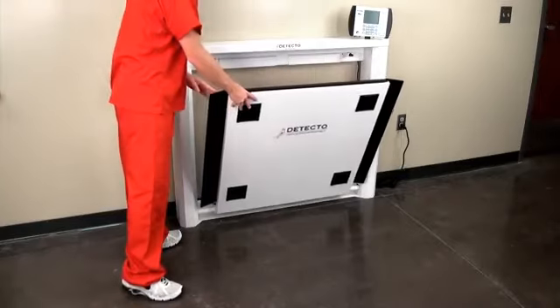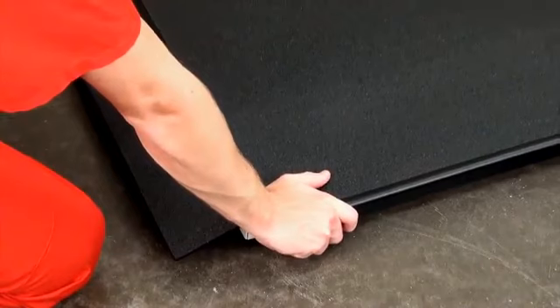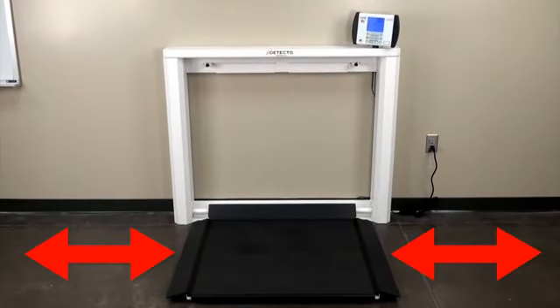When you're ready to weigh, simply lower the platform and the gas spring lifting mechanism will gently lower it into place. Two-way ramps provide easy access from either direction.